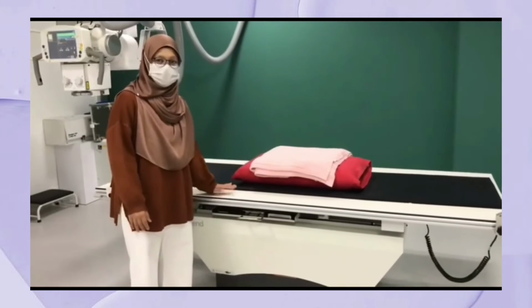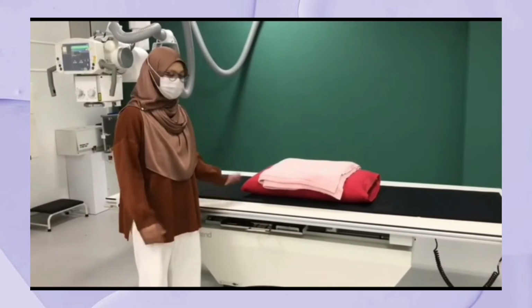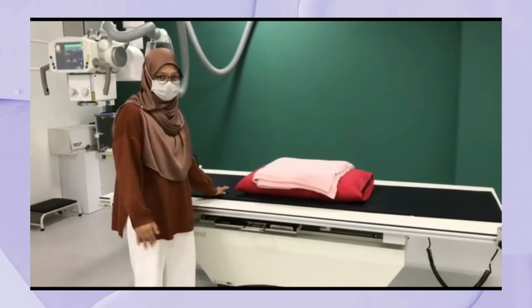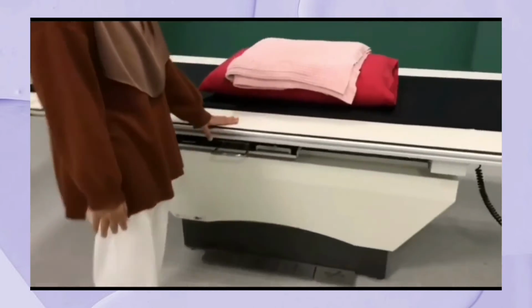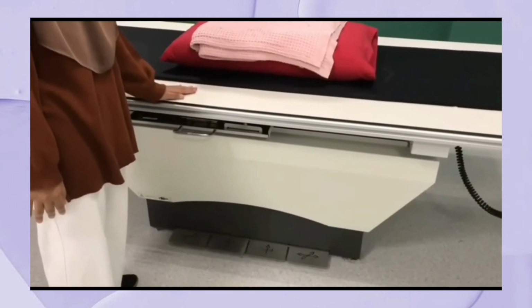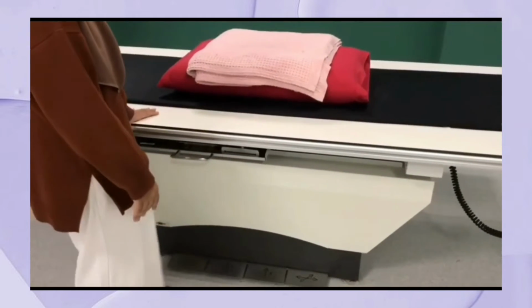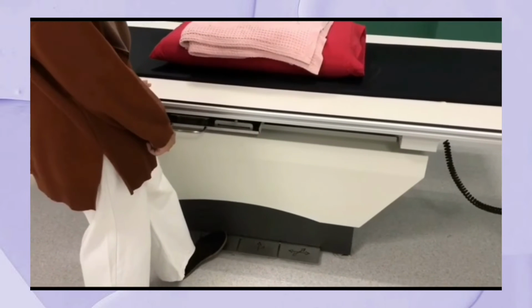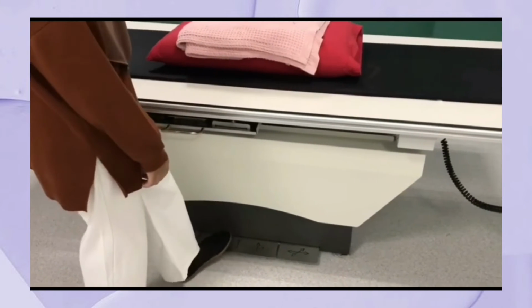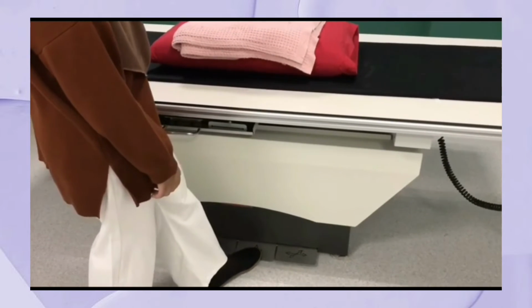So next, this is the X-ray cot, and this is where the patient will lie. Okay, so we can move the cot up and down. We just need to step on this pedal. Okay, this is how we go up.